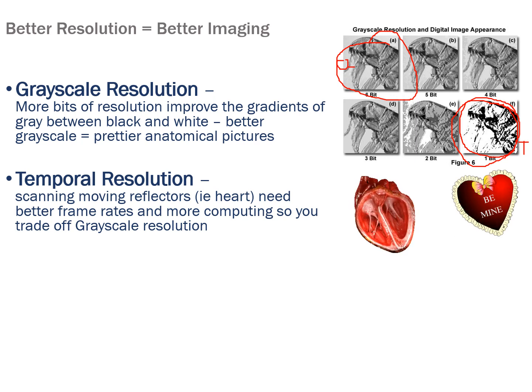You can't have everything because you'll affect the processing speed and the frame rate, and it will start to jump. Just like when you have a bad internet screen because your connection is poor and your screen takes a long time to refresh, you wouldn't want your heart valves to be doing that because you might overinterpret that screen processing error as a clinical error.